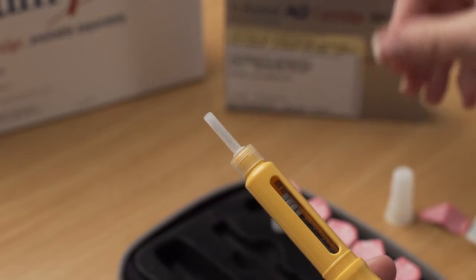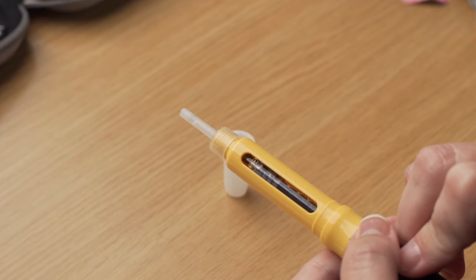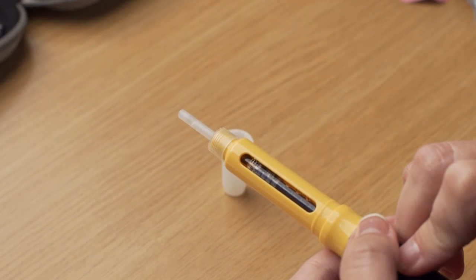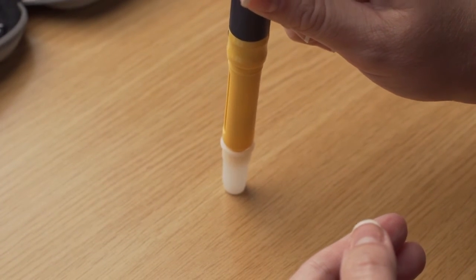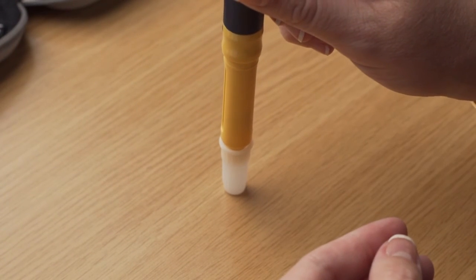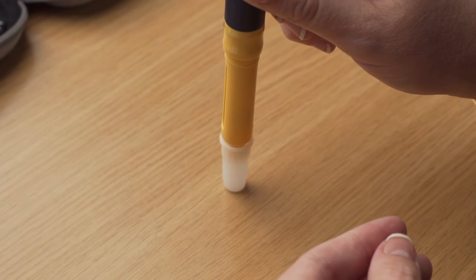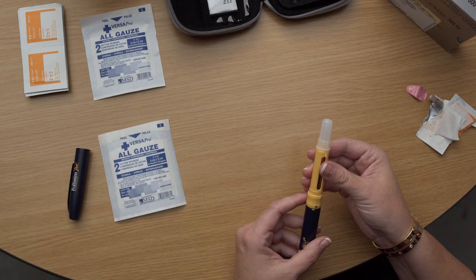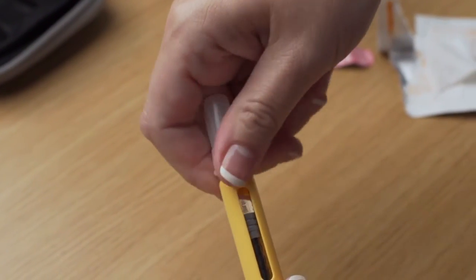Now you need the outer needle shield that you saved earlier. Put it on a flat table surface with the opening pointing upward. Allow it to sit freely and do not hold it, to minimize the risk of puncturing your finger with the needle. Carefully insert the needle still attached to the pen into the opening of the outer needle shield and push down firmly. The outer needle shield should be attached to the pen and cover the needle. Grip the outer needle shield and use it to unscrew the needle from the cartridge holder.